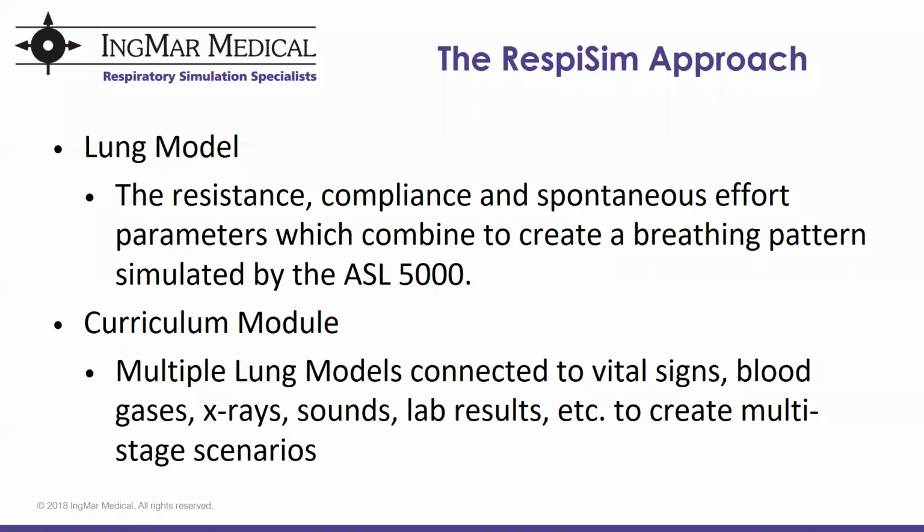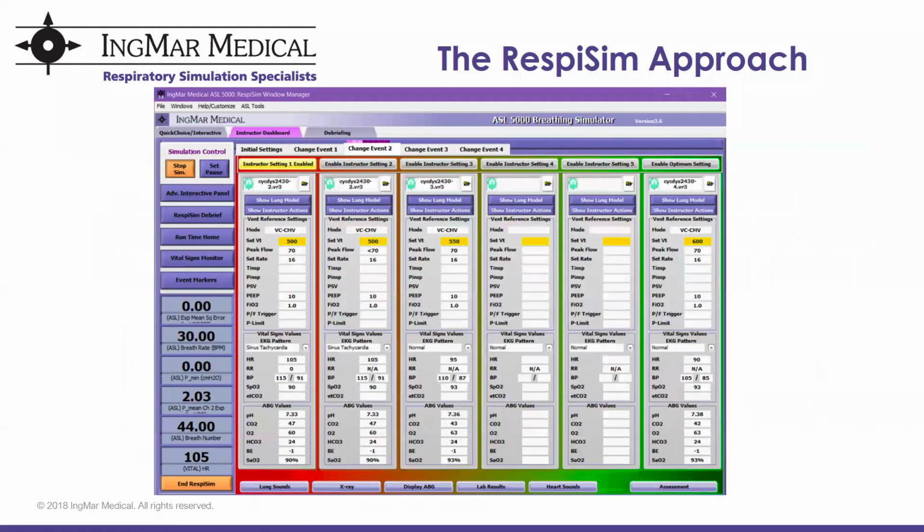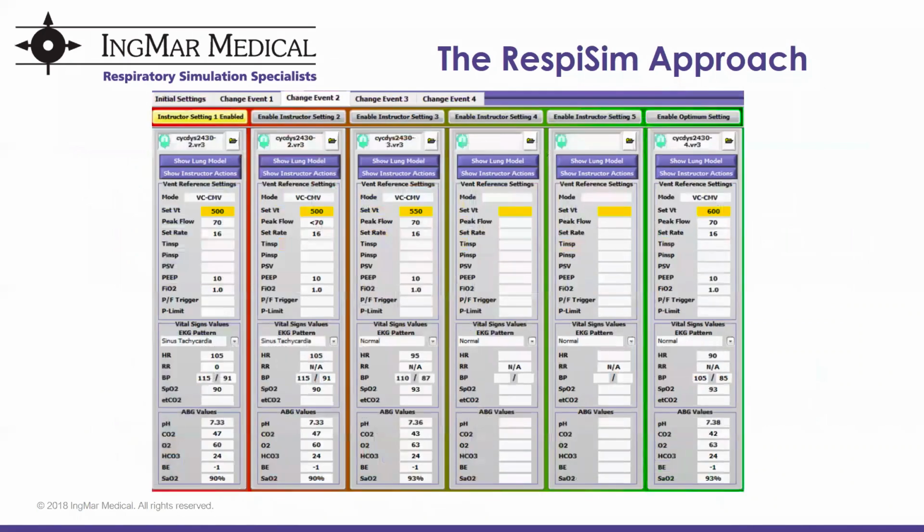We call these scenarios curriculum modules. Here you see our instructor dashboard, which is the environment the instructor uses to control our curriculum modules. Within a curriculum module, we have multiple columns which represent the patient's condition at a given point in the scenario.